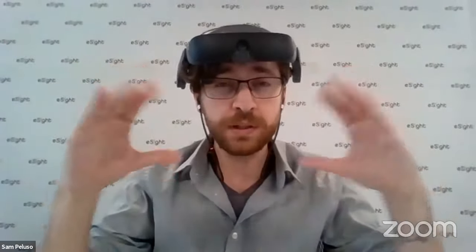Other common conditions like glaucoma, retinitis pigmentosa. If you've got tunnel vision, if you've got poor peripheral vision, this device is not going to increase your field of view. This is not going to improve your peripheral vision. This device is designed for central vision loss. So if you are an individual who is still benefited by magnification, it may still be worth testing the device out and seeing if it works for you. I encourage you to reach out and see what your options are. Just be aware this isn't a device that's going to replace a white cane or a guide dog or a walker or something like that.